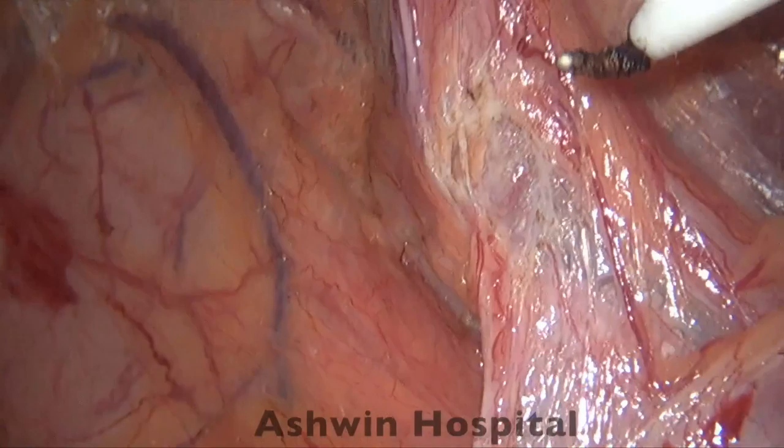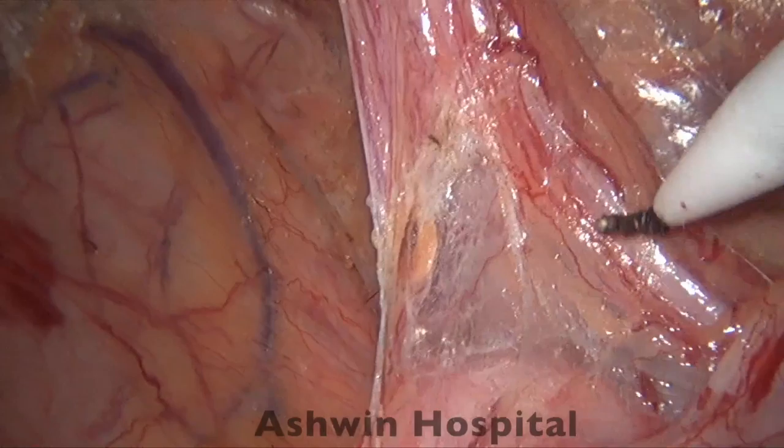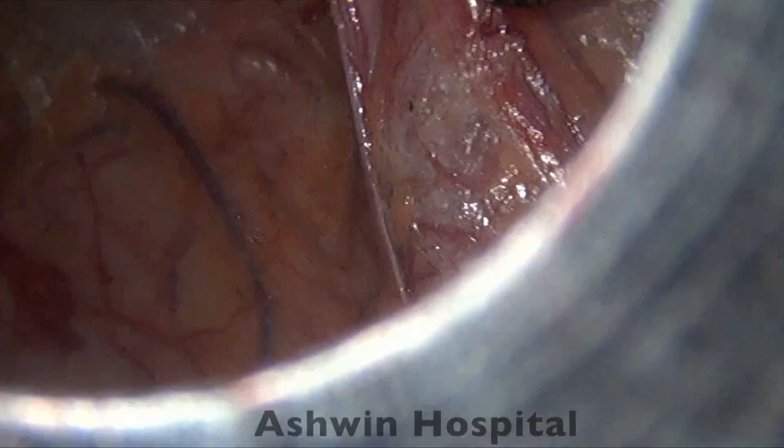Once again we can see how the dissection is being done and the parietalization is being carried out. We are just making sure that no fascial attachments are present and all the structures are mobilized well. So now you can see how the parietalization and the mobilization have been done very well as well. You can see we don't have to keep chasing for the vas; it will automatically come into the picture. We have to take care that we stay very close to the peritoneum and flush with it.